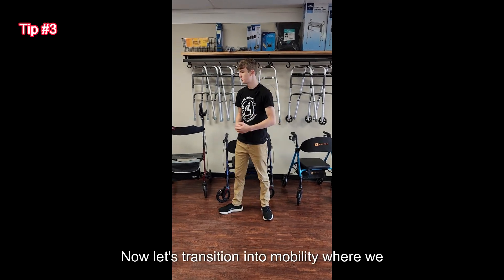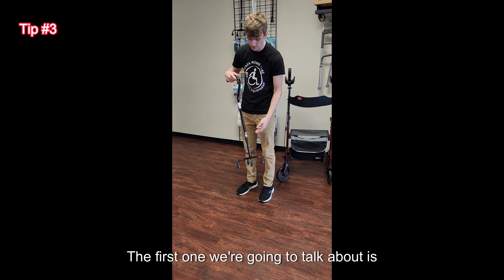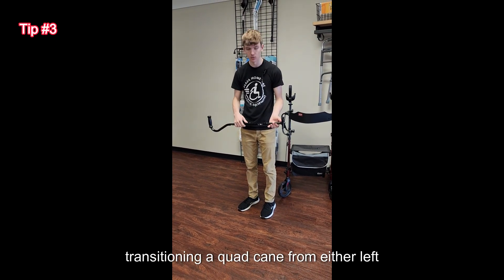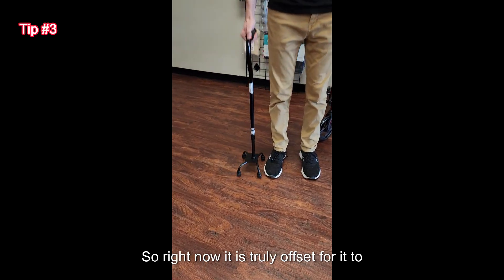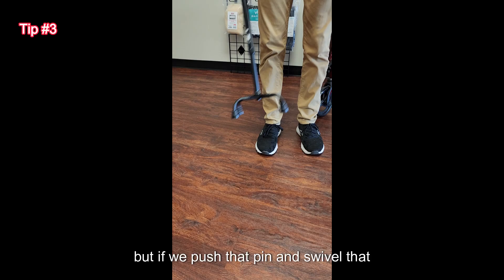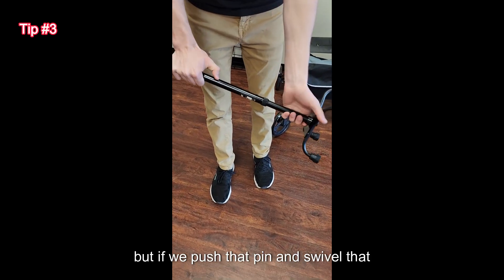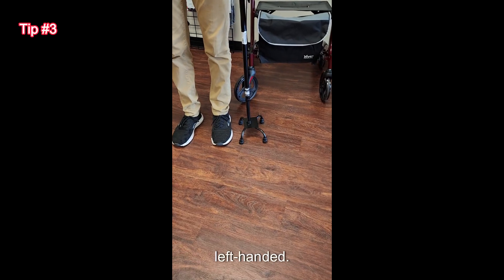Now let's transition into mobility where we have several tips for you. The first one is transitioning a quad cane from either left or right hand. Right now it is truly offset for right-hand use, but if we push that pin and swivel that base around, we can switch it to be left-handed.